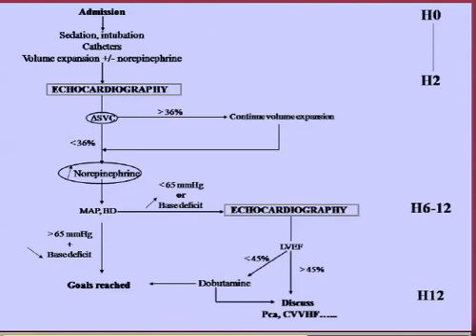We may propose this kind of protocol, maybe in a septic shock patient. At admission, you have to sedate, to intubate the patient, to put in the catheters, to give volumes, and most of the time to start norepinephrine. After 2 hours, the first step is to perform an echocardiography by the transthoracic or the transesophageal route to check the efficacy of the early resuscitation.